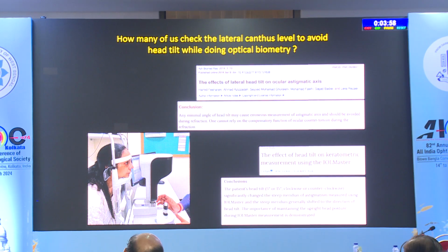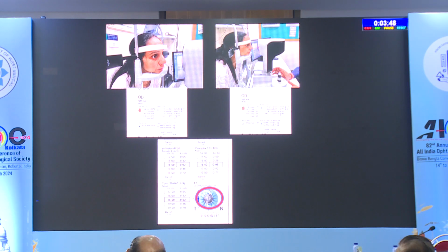Now, how many of us have actually looked at a patient when the biometry is being done? If there is a head tilt, it affects your axis results. There is enough literature and publications which tells us on how it affects. So this is for demo purpose.